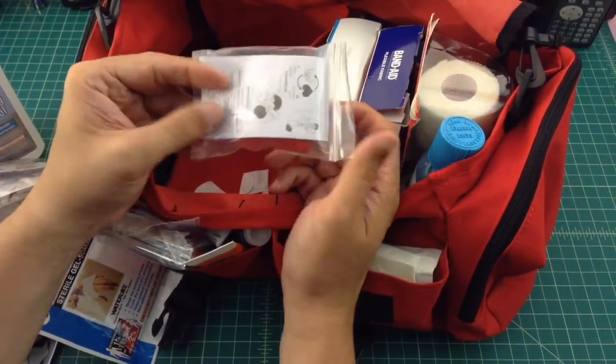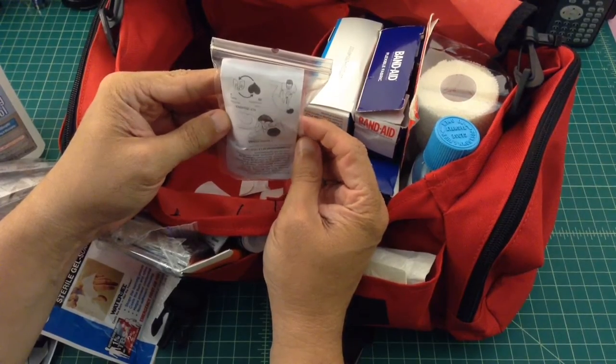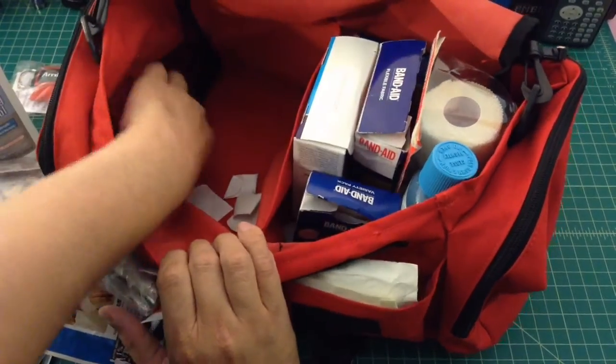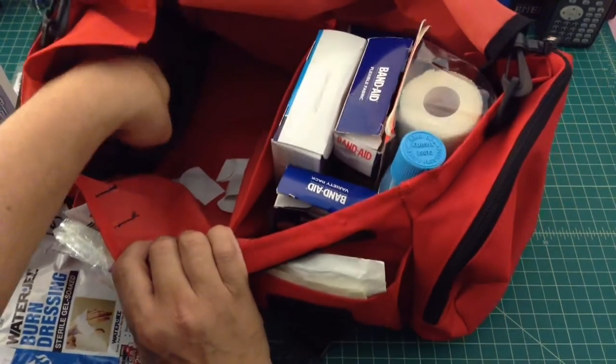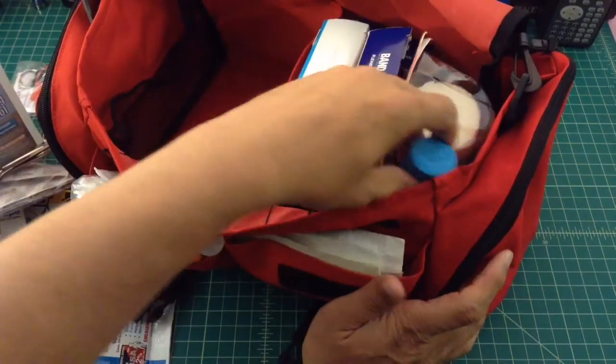I think this is something that came with an order I made — it looks like one of those CPR first aid masks. I probably wouldn't use that since I don't know how to. Also a pair of shears.